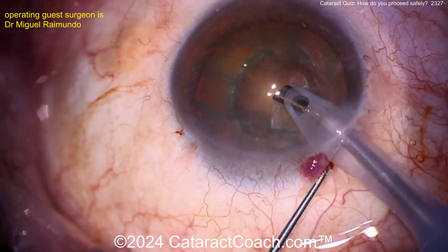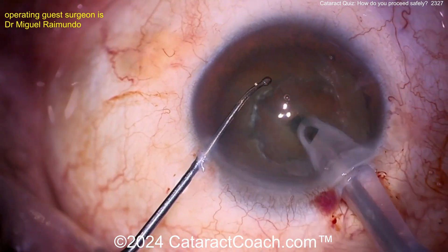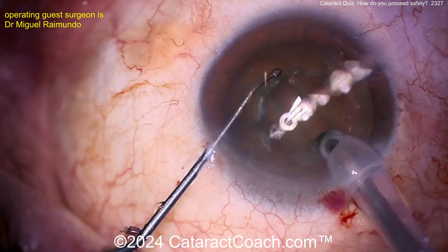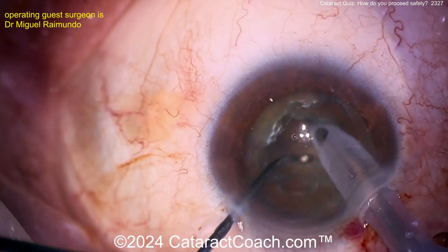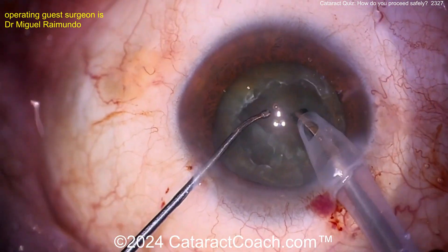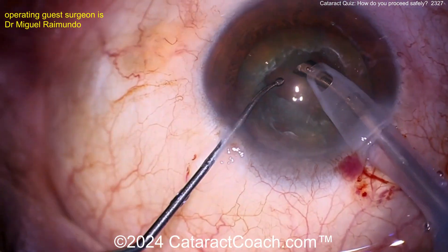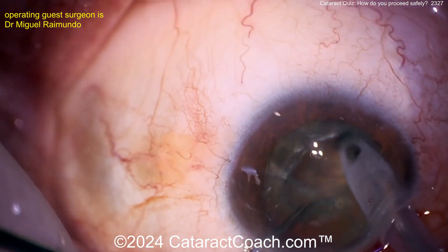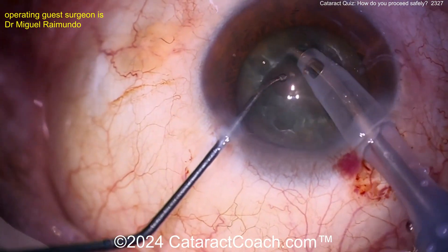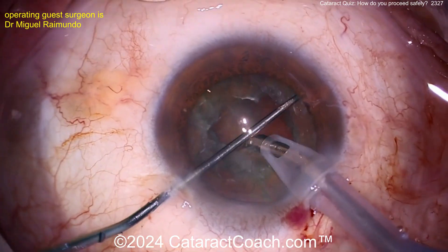We've sped the video up. Going with a blunt-tip chopper — groove down the middle is a reasonable approach. Stop-and-chop technique: split it in half, then bring each half up out of the bag. Don't work in the bag so much. Divide and conquer, even into little quadrants — whatever works in your hands. Let's just get this lens out of the eye.